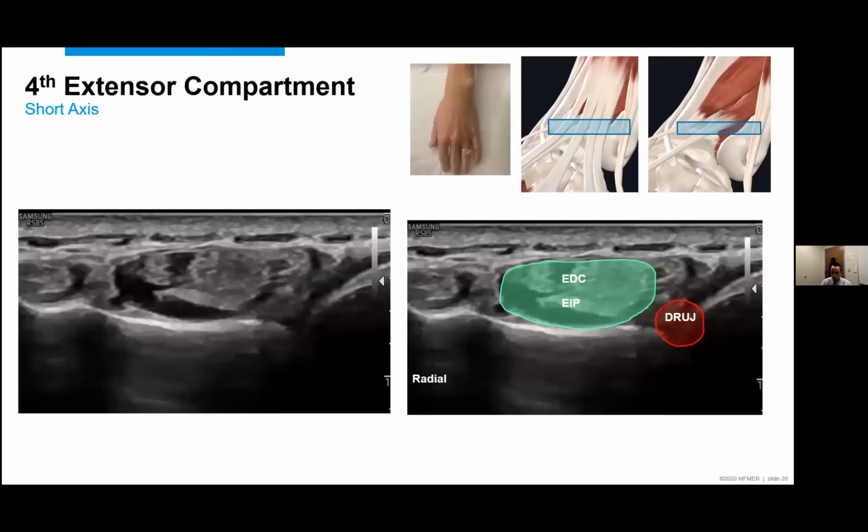So you might think we're done. We covered the distal intersection syndrome. We saw the pathology of our case. But as we know, usually we save things that are pathologic, or we think are going to be pathologic, for last because we don't want to miss other things. So we must continue our scan.